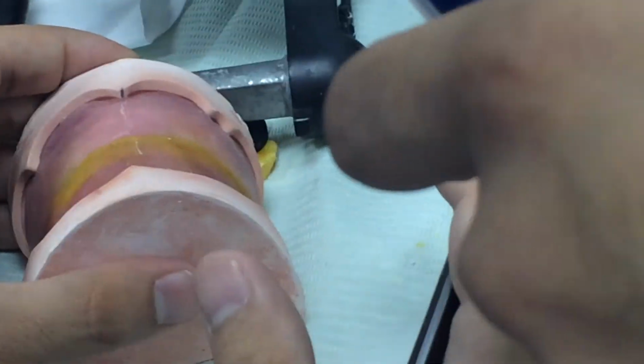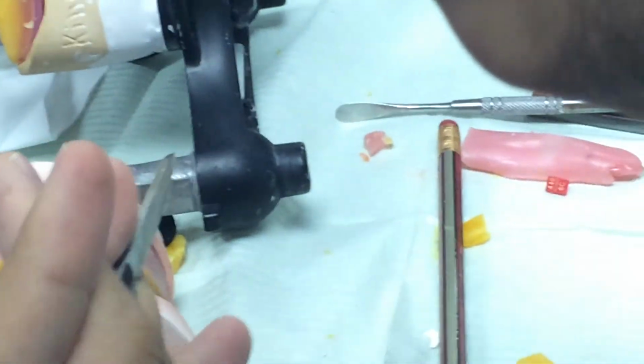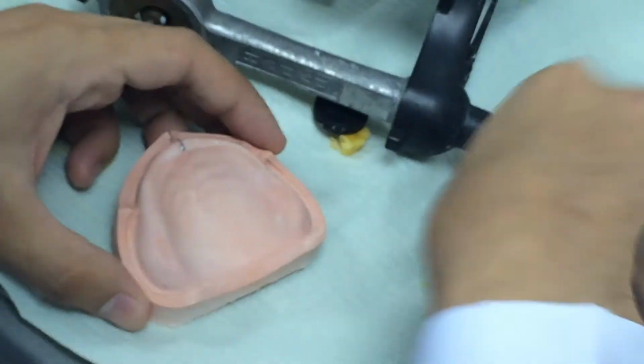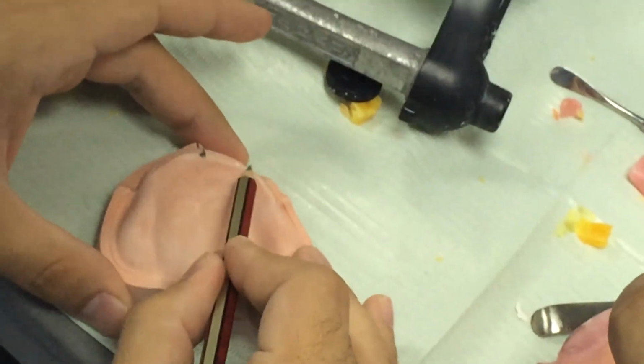First of all, the most important line is the midline. Guidelines for a canine sometimes don't come out perfect because of the different sizes of the teeth in the set, but it gives you an idea that there is a curvature like this.